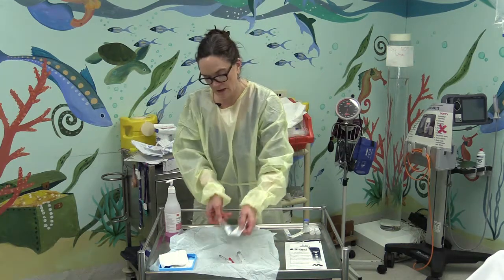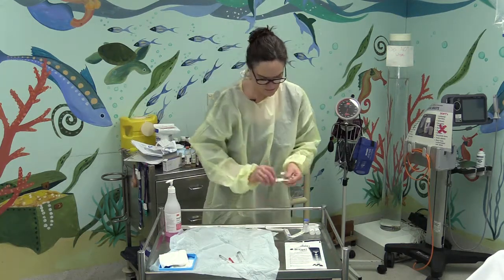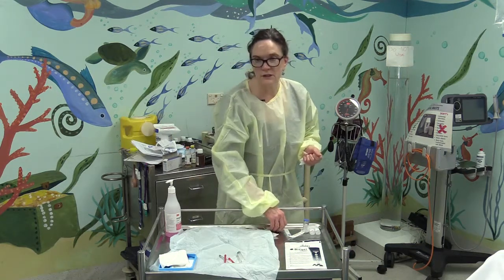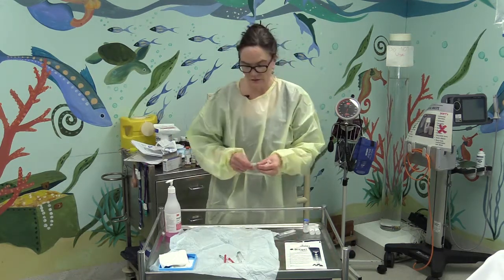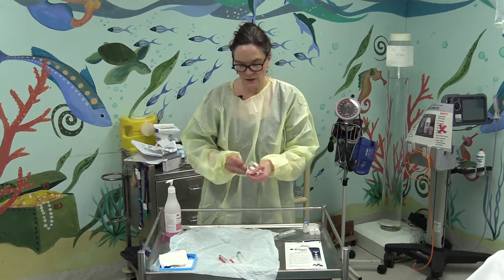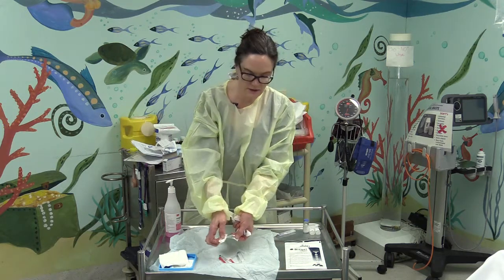Syringe for my gentamicin. And I'm going to open up a drawing up needle and an injecting needle for each medication, so for each syringe. So I've got 2 drawing up needles and 2 sharp needles for injecting.